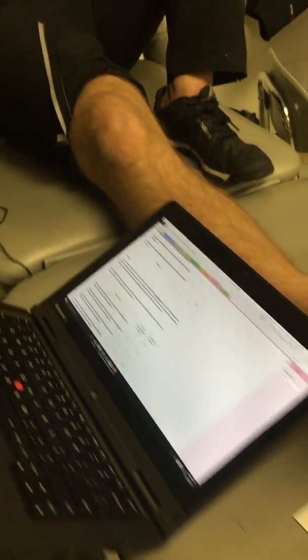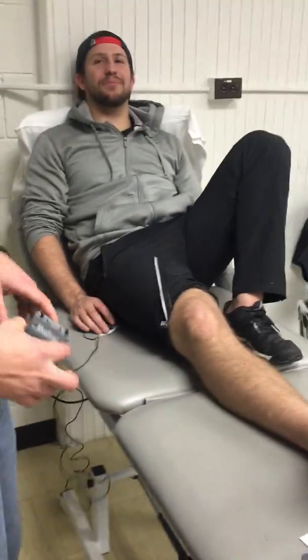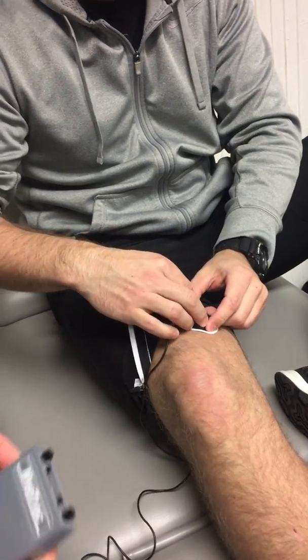We'll incorporate biofeedback using Myotrack to facilitate VMO re-education. We're going to take the leads of the Myotrack device — these two top leads — and line those up with the muscle fibers on the VMO.